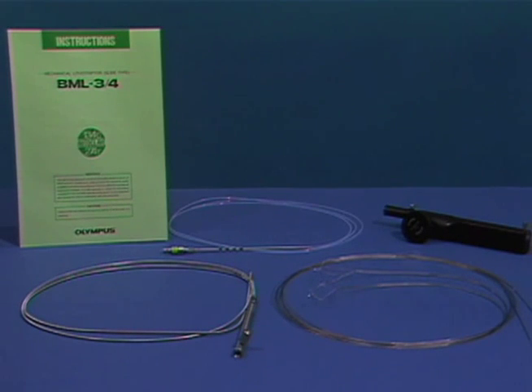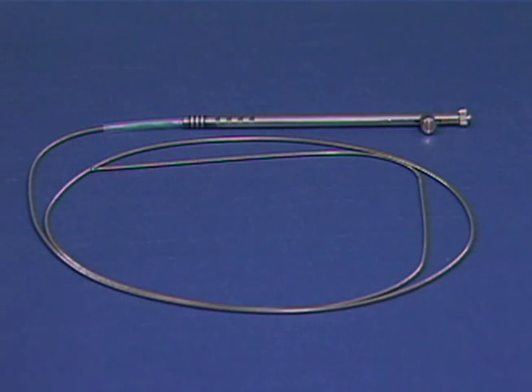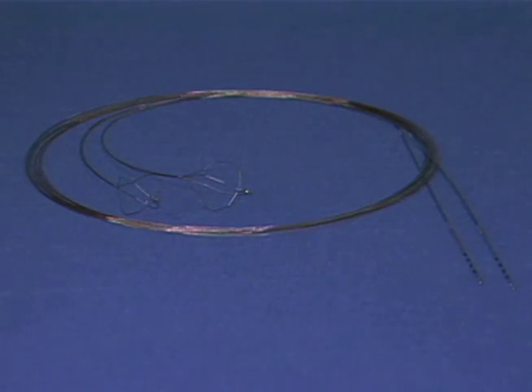The mechanical lithotriptor is comprised of four components: a handle, a coil sheath, a Teflon sheath, and a disposable basket.